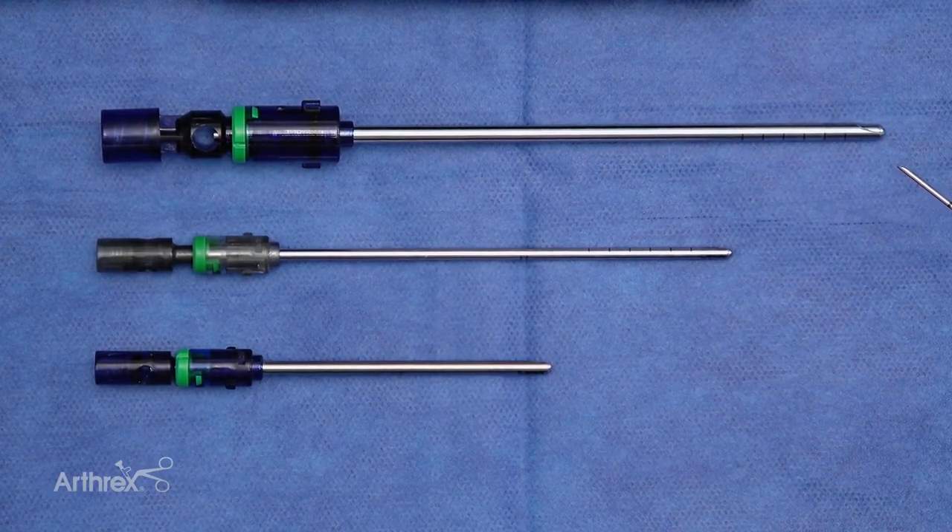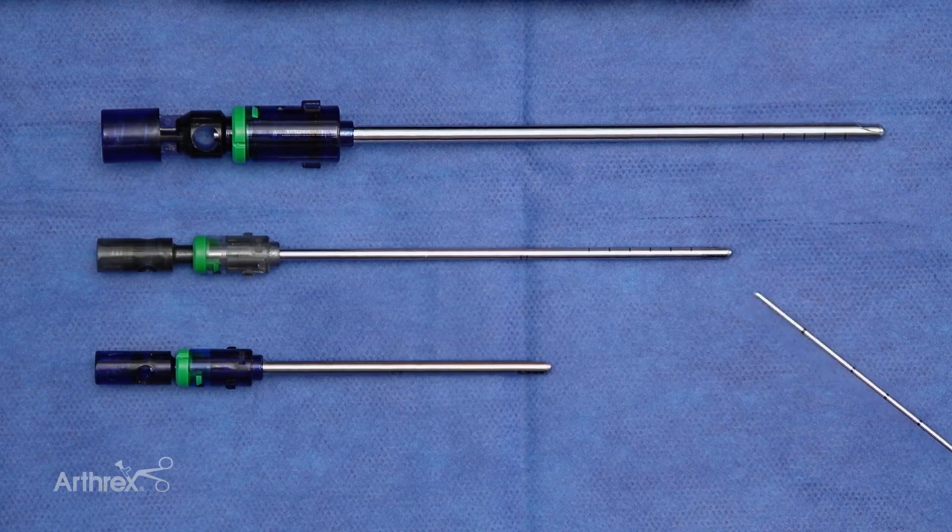we see the standard Sabre 4.0 millimeter by 13 centimeter, the Nano Sabre Shaver 2.8 millimeter by 11 centimeter, and the Dex Sabre Shaver 3.0 millimeter by 7 centimeter.